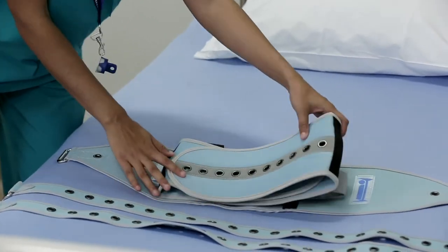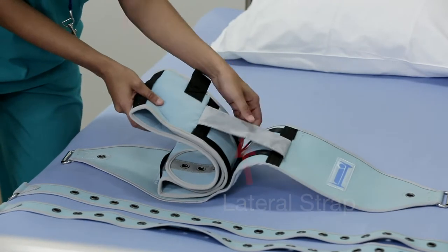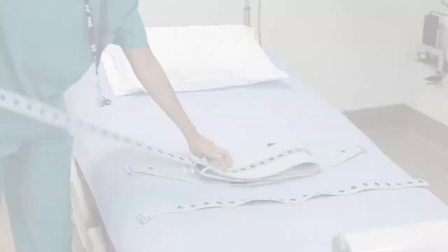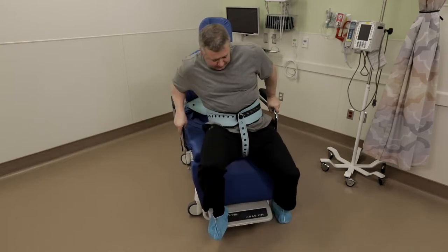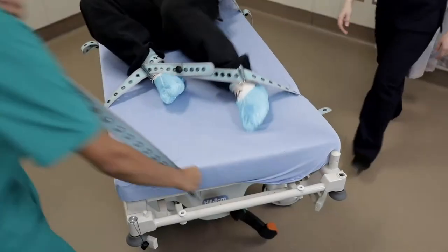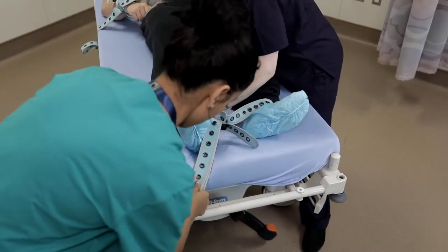For exceptionally strong patients, the sewn-in lateral strap may not be strong enough. The utility strap can be inserted in the buckle to provide extra strength to prevent rotation over the side of the bed. In a chair, the utility strap can be used as an extender to prevent the patient from sliding downwards. The strap can also be used as a restriction to the limb belts — for example, to prevent a patient from reaching the velcro cuff and pulling it apart. At the feet, the strap can be attached to the limb straps at the end of the bed to prevent the patient from pulling their legs upwards.